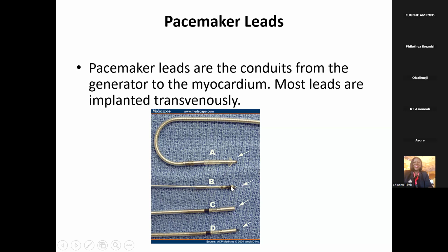So that brought about the idea of putting drug coating around the tips of the electrodes. They call them drug coated leads. Steroids are actually put in there. The purpose is to reduce inflammation when you screw in the electrodes and reduce inflammation around the myocardium. And the moment inflammation is reduced, you can still maintain the threshold at which you started, because fibrosis is not formed very fast. And so that helps the electrode to merge well with the myocardium and delays fibrous tissue formation.